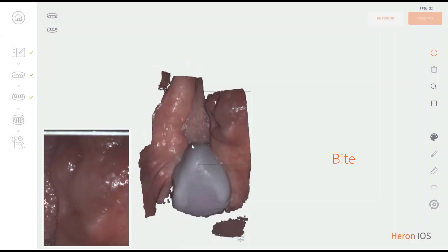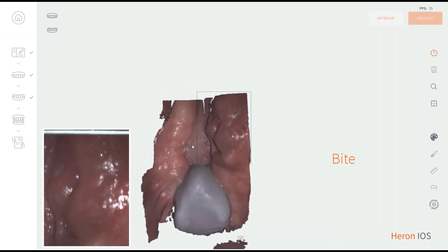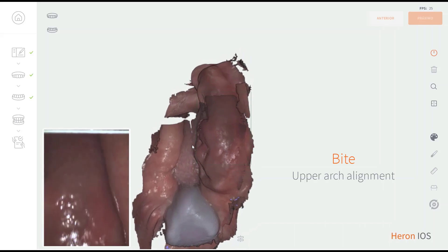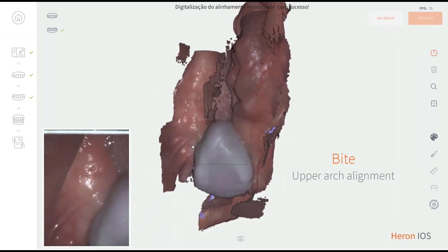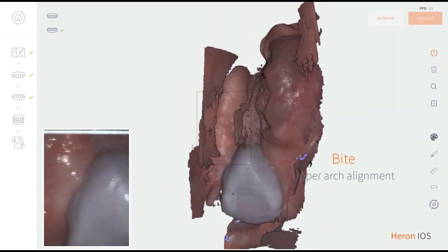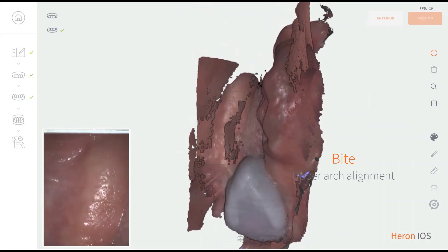Bite distance in this case is set by placing one silicone jig on each side, which will also be useful as a bridge to shift between upper and lower while scanning the bite. Scan the surrounding area of the jig until both arches are aligned.